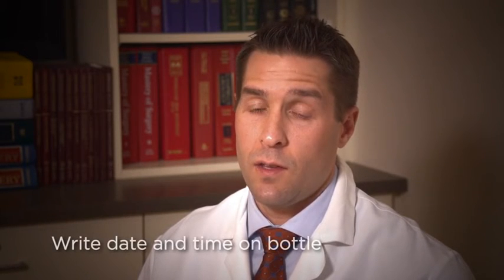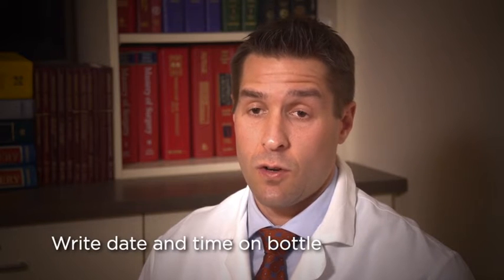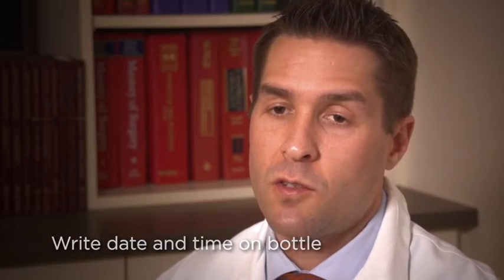The collection can be started at any time. We would suggest 7 a.m. or when you first wake up in the morning. To start the collection, go to the bathroom, empty your bladder, and flush this void. This will be the official date and start time of the collection. This way you are starting the collection with a clean slate. Mark this date and time down on your collection bottle with a marker.